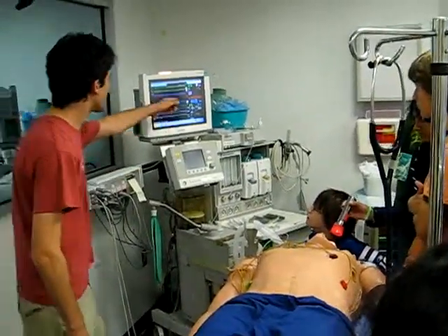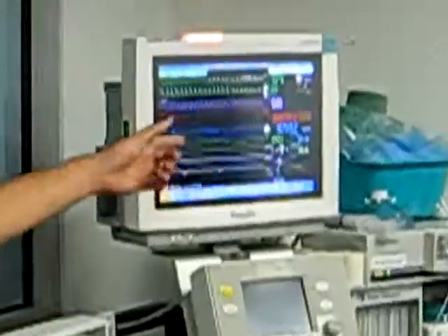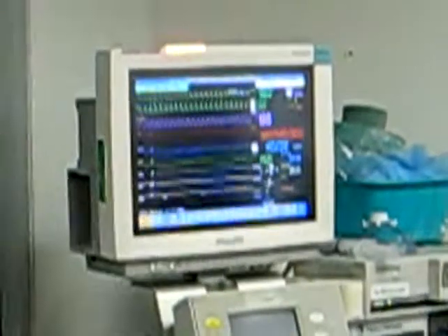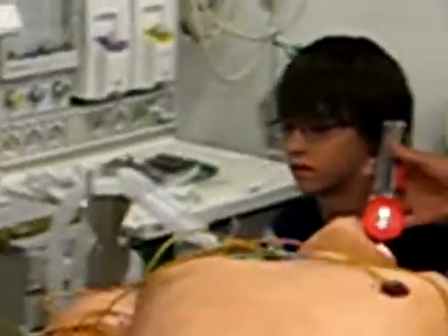So you can see his blood pressure skyrocketed to like the 170s, and his blood pressure right here, that's increasing. This number should be like around 120 or 110. So that's going really high up. And now, unfortunately, I think we killed Stan. So you'll see in a second. His blood pressure's going down, isn't it? Yeah, his blood pressure's going down.